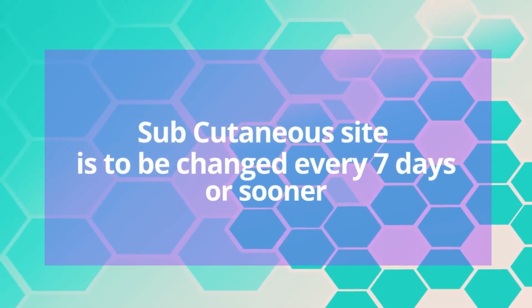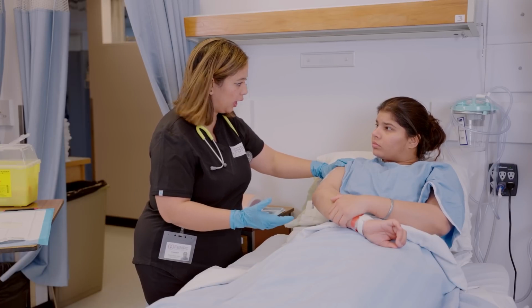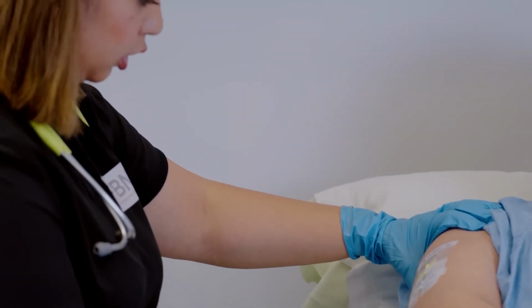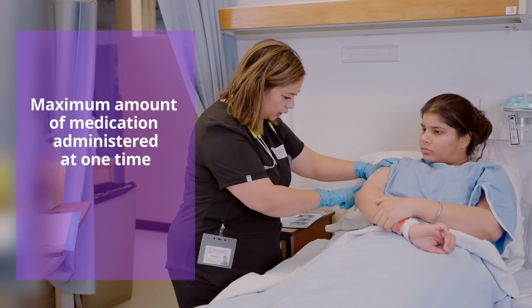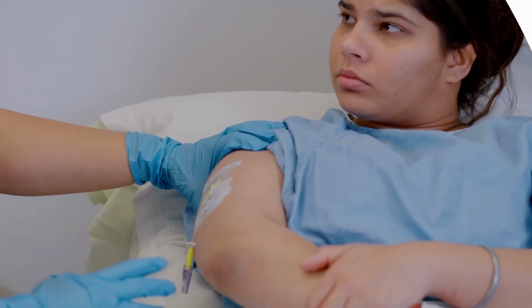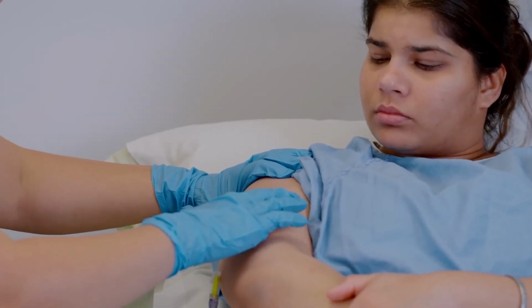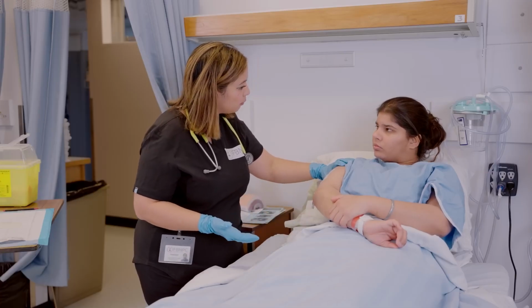Most of the time you would see the physician orders written as change every 7 days or PRN as necessary. To optimize the comfort and medication absorption, the maximum amount of medication administered at one time should not be greater than 2 ml. If the volume is greater than 2 ml, 2 sites can be used to deliver the same amount of medication. If blood appears in the tubing, remove and discard the subcu set and select a new injection site.